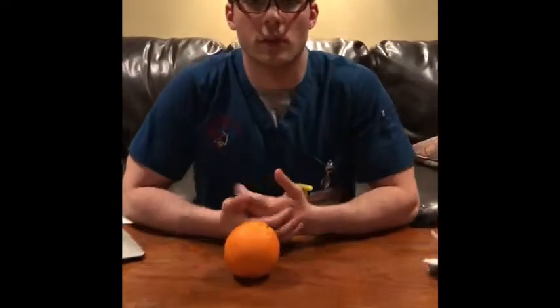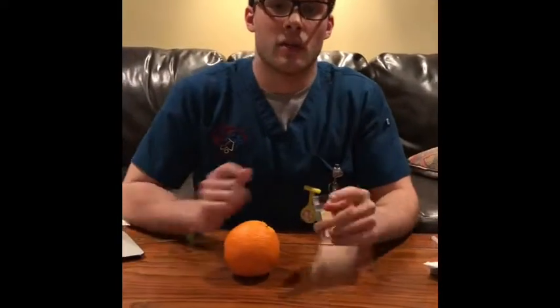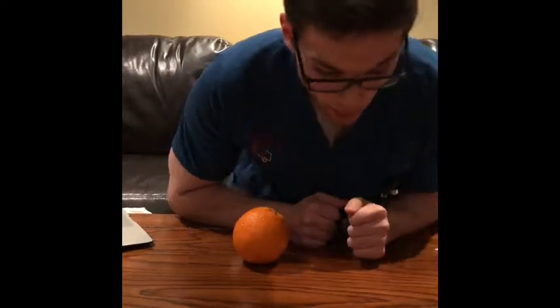So for intramuscular injection, you can do deltoid or the lateral aspects of the leg. Today we'll be talking about deltoid. So what's different with this one is once you inject the needle, you can aspirate slightly to ensure that you haven't gone into a vein. So I will be doing that once I administer the needle.